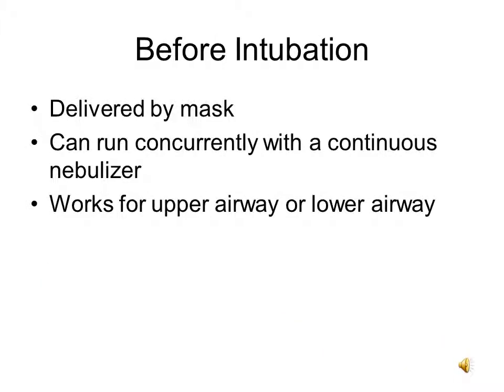While it is our policy that Heliox should be used in an ICU, exception to this rule is possible. Notify your supervisor and advise nursing the patient may be on Heliox while on the floor for a short period of time, during which the patient is to be kept close to the nurse's station until an ICU bed can be obtained. You'll find most Heliox here is utilized in the pediatric ICUs. ER does use it occasionally as well.